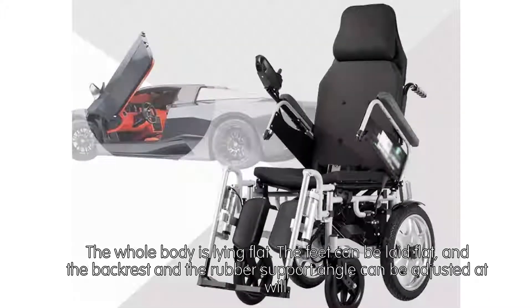The whole body can lie flat. The feet can be laid flat, and the backrest and rubber support angle can be adjusted at will.